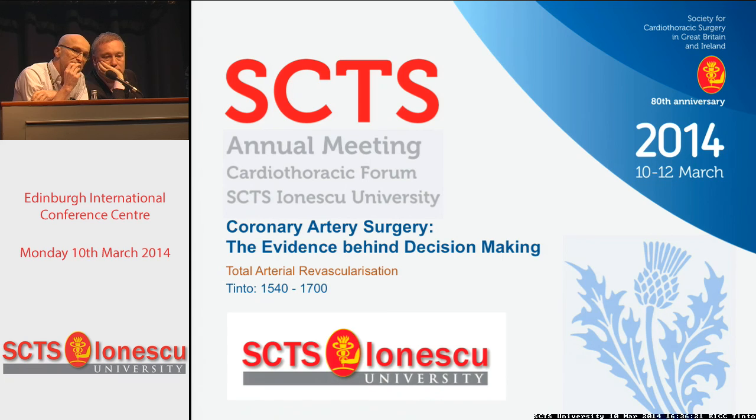Let's say you went to theater with a moderate lesion and you did not have FFR, and you did a TTFM, which shows that there is competitive flow. What do you do in that situation? Well, but then you've done the graft. Exactly. So you know, pray. The graft is going to go down because you've got competitive flow. What do you do?